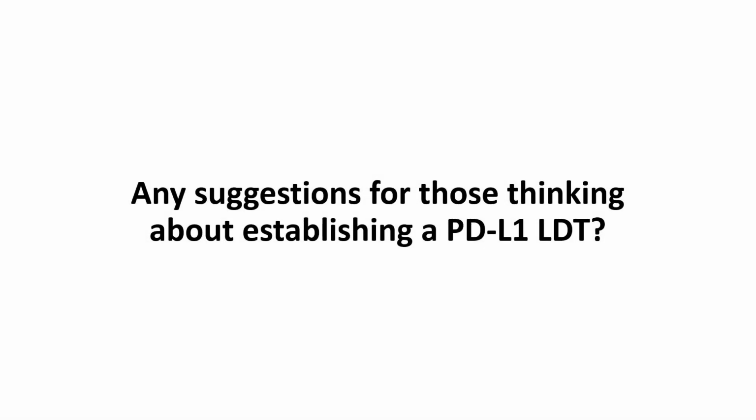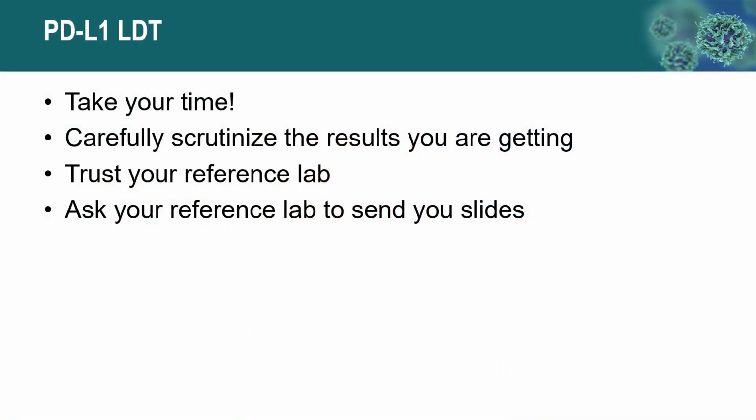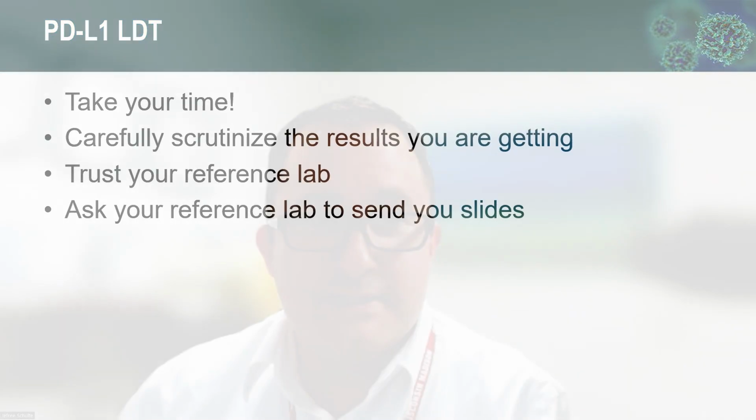If you were to give suggestions to anyone who's thinking about establishing a PD-L1 LDT, what are some things that you would want to make sure that they remember as they plan that process? Don't rush it. Take your time and really carefully scrutinize the results you're getting. Make sure you trust whoever you're using as a reference lab. And one thing that I do as an IHC director is if something just seems off, it's okay to ask your reference laboratory to send you slides so that you can actually lay eyes on them yourself. Most will actually accommodate that request.